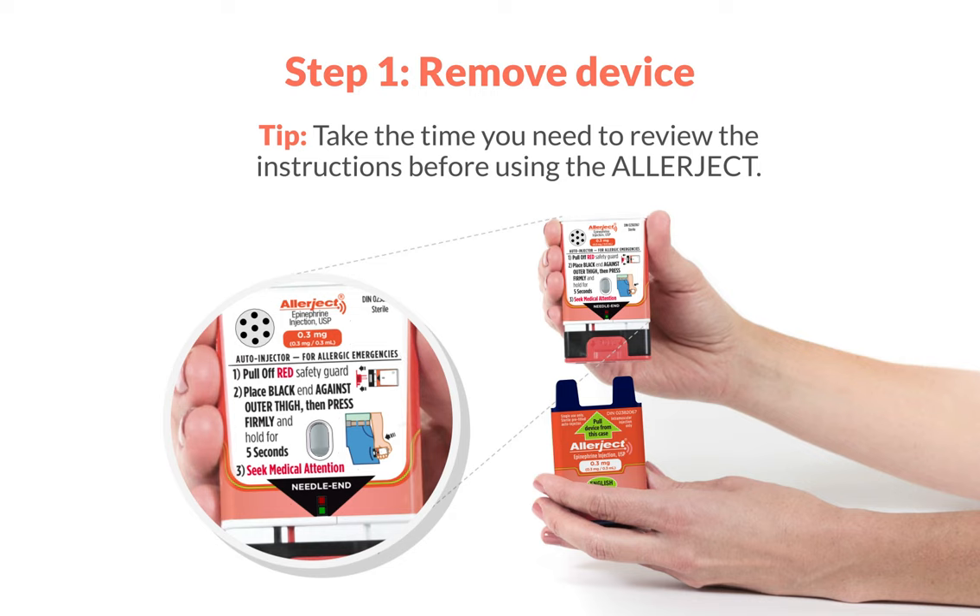Step 1. Remove Allerject from the outer case. Removal from the case will activate the voice instructions. Remember, you can still use Allerject even if the voice instructions do not work, or if it's difficult to hear because of loud noise around you. There are also written instructions printed on the device.